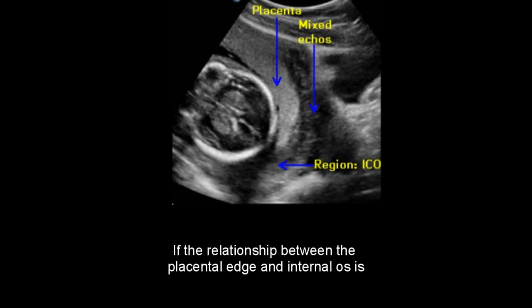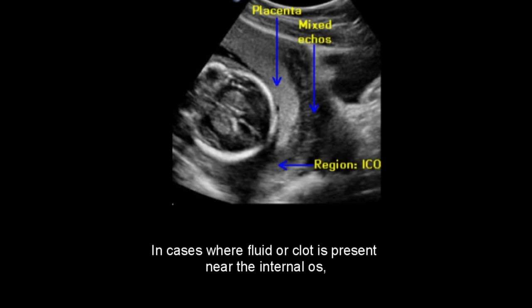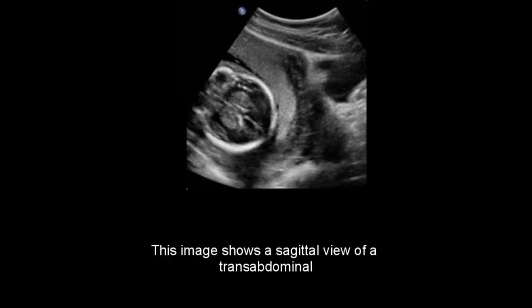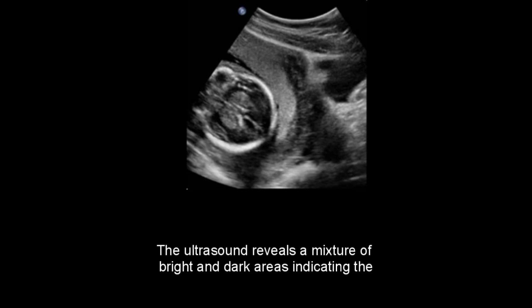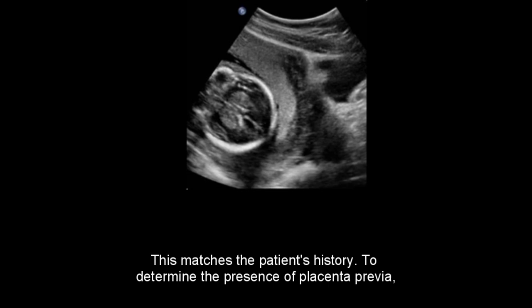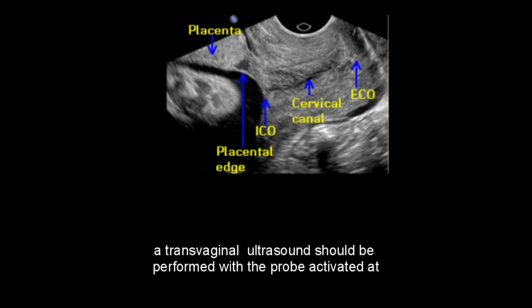If the relationship between the placental edge and internal os is unclear, a transvaginal ultrasound should be performed. In cases where fluid or clot is present near the internal os, a transvaginal ultrasound may also be necessary. This image shows a sagittal view of a transabdominal ultrasound where the placenta extends to near the internal cervical opening. The ultrasound reveals a mixture of bright and dark areas, indicating the presence of fluid or blood clots, consistent with the patient's history. To determine the presence of placenta previa, a transvaginal ultrasound should be performed with the probe activated at the start of the exam.